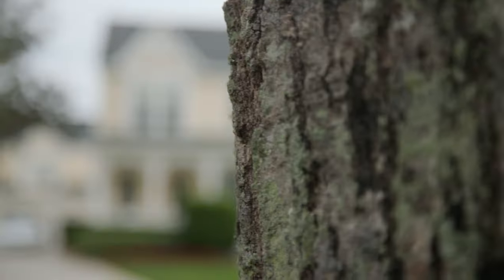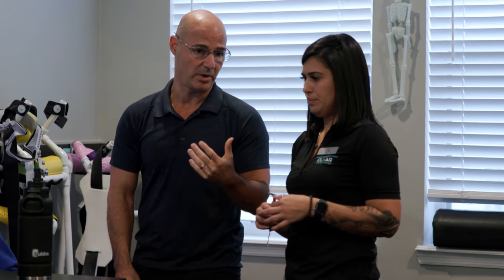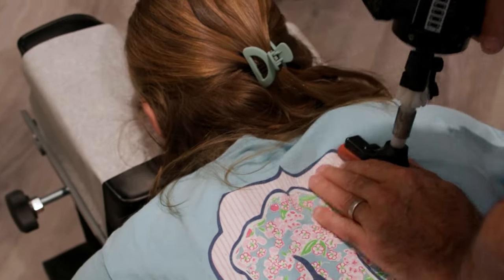Measuring a scoliotic curve is a very important thing that must be done on a specialized x-ray, and it's classified by severity, type, and location to help determine the correct treatment plan, customized to match each individual patient. Here at Scoliosis Reduction Center, I diagnose, assess, and proactively treat scoliosis patients of all severity levels and all ages, from infants to late-stage adult life. We see curves from 10 degrees up to the largest I've ever seen — 155 degrees — and we monitor patients throughout with x-rays to ensure they're responding appropriately.